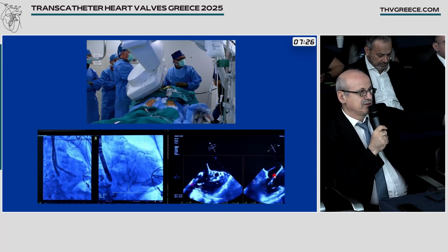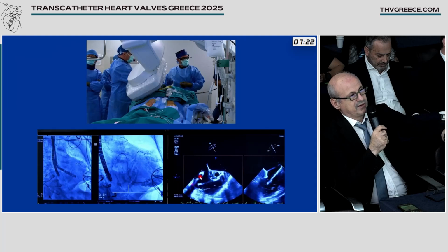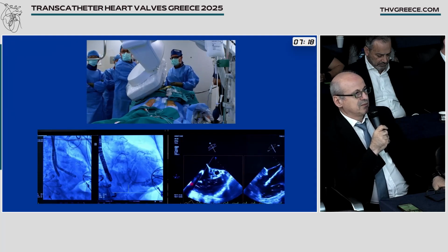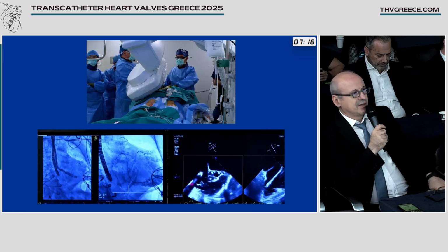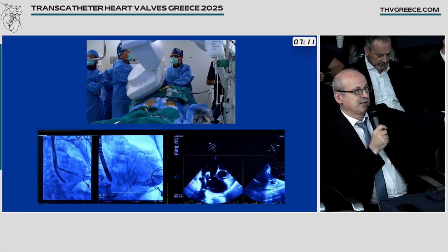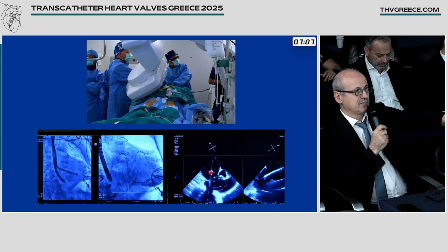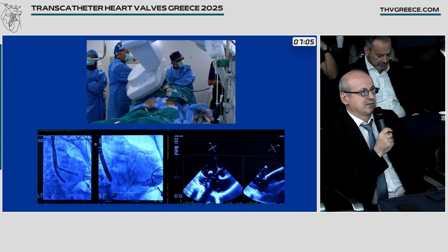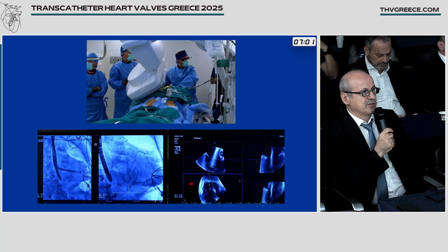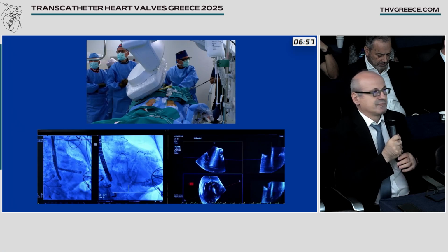The other one you cannot see well because you have to bring the caliper across, but probably we'll see it later. It appears to be in the center. It may have a posterior trajectory. Now, yes, you can see he moves the caliper there. It's quite central, probably with some slight posterior trajectory, which you can correct by flexing the system.